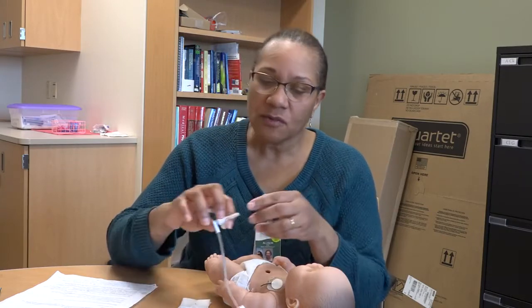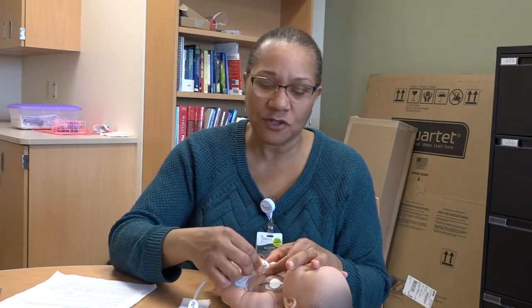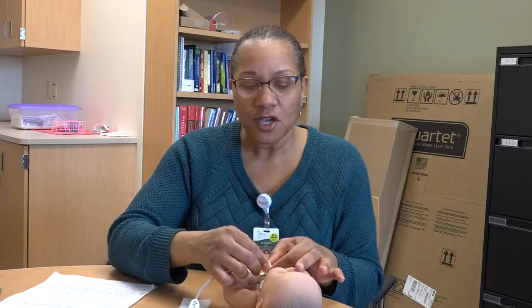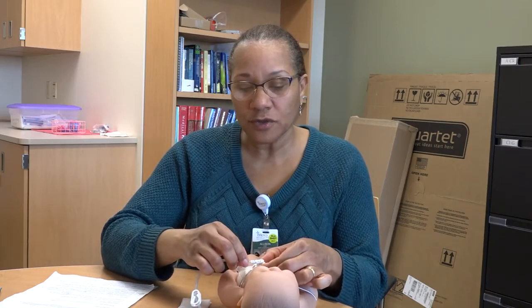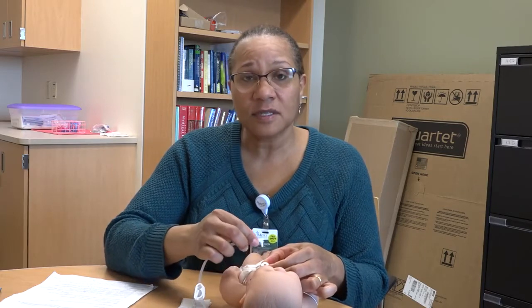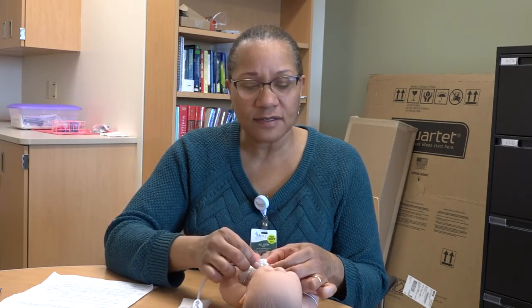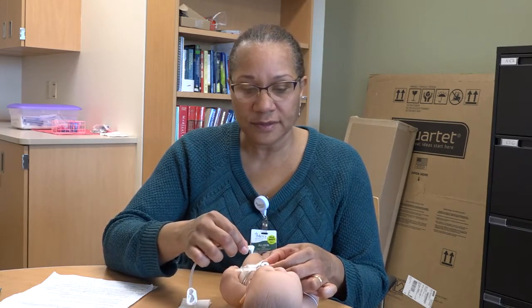What I mean by that is, when the G-tube is in place and you're accessing and de-accessing with your feeding tubing, you want to hold on to it so that you're not just pressing down on the baby's skin and stomach. You want to stabilize it as you are accessing and de-accessing. Sometimes the babies will let you know they're uncomfortable by that action. That's what I mean by tenderness or some pain when you're accessing and de-accessing. They really should not be uncomfortable when you're performing those movements.